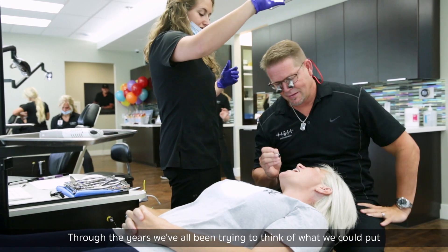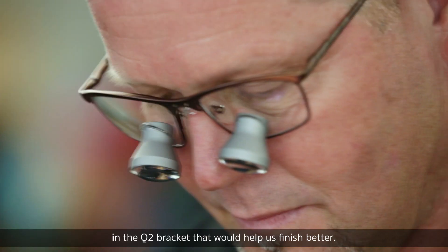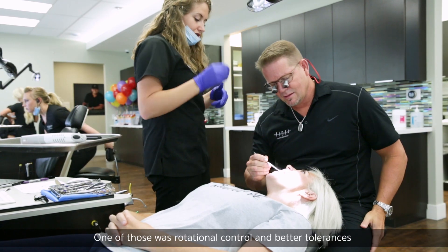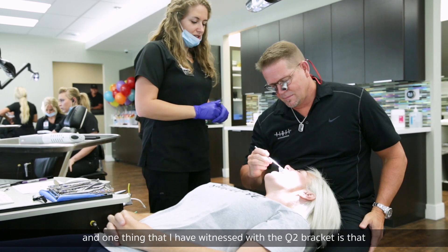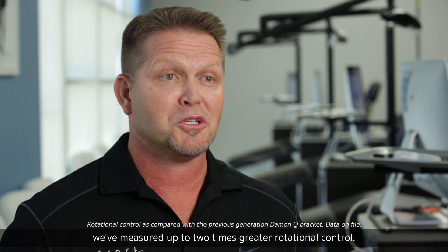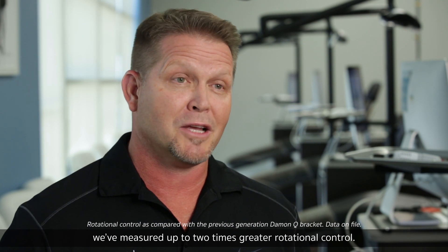Through the years, we've all been trying to think of what we could put in the Q2 bracket that would help us finish better. One of those was rotational control and better tolerances, and one thing that I have witnessed with the Q2 bracket is that we've measured up to two times greater rotational control.